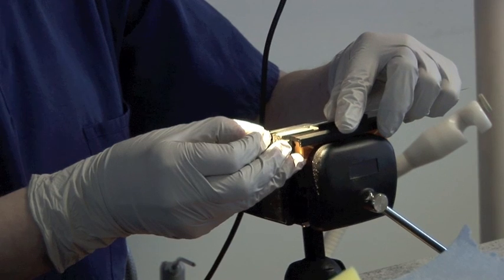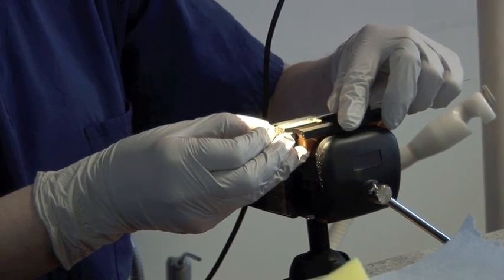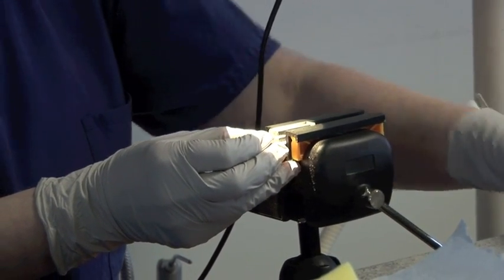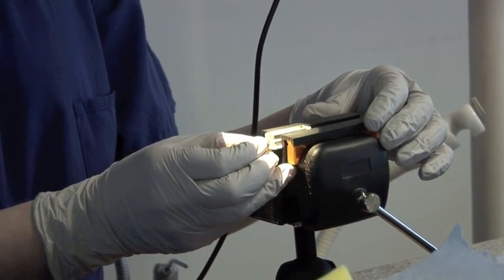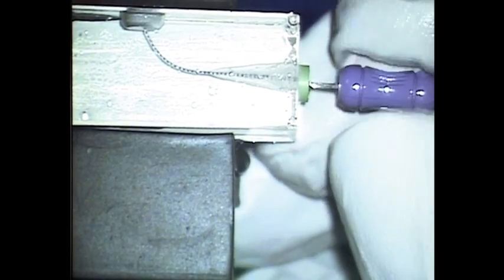For your preparation you have to come back to the apical constriction — you will have to come back one millimetre from here, so your working length will be 16 millimetres. However, because this file easily goes down to 17, we'll keep this as the patency file. That keeps the canal patent and stops any blockages. In a patient you might see some exudate coming from the canal, and it's very important to use this patency file in between every single file that you use.